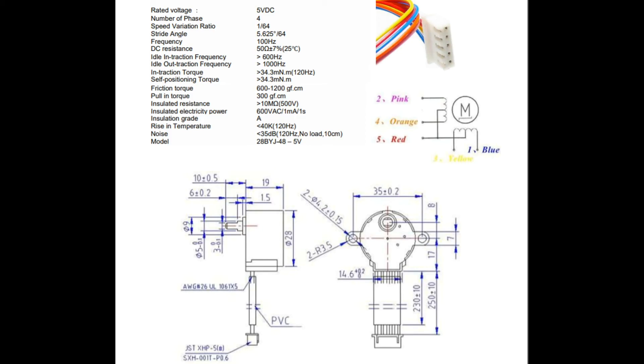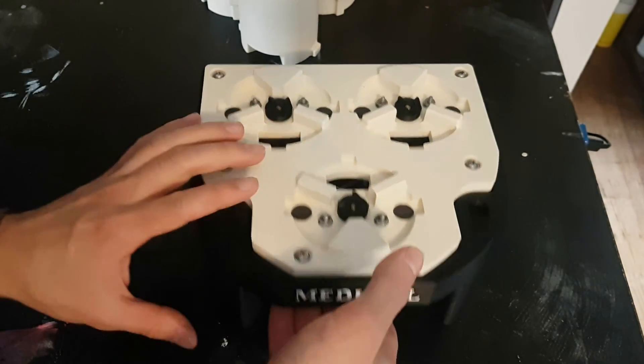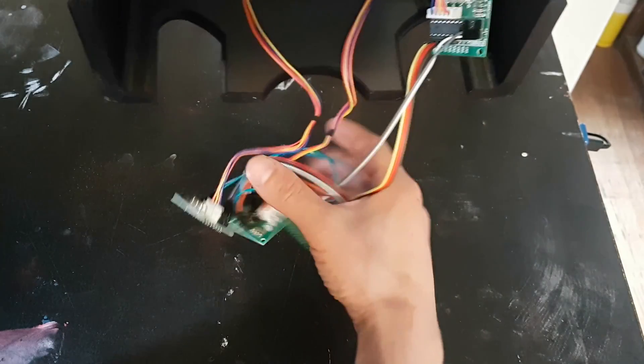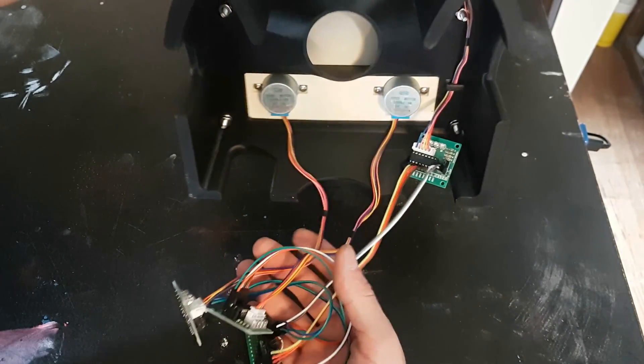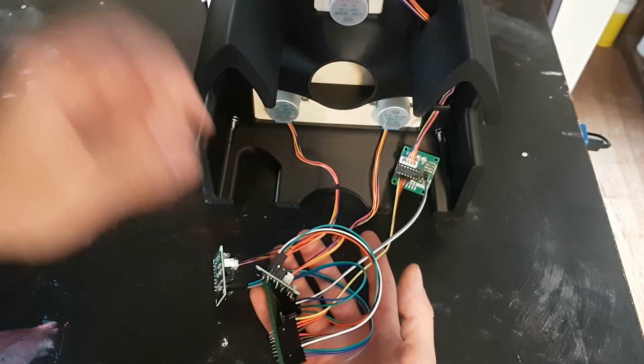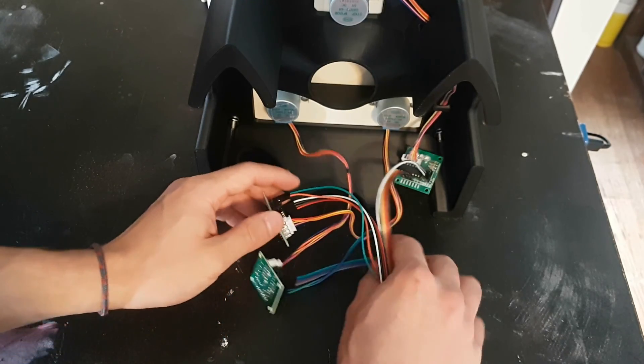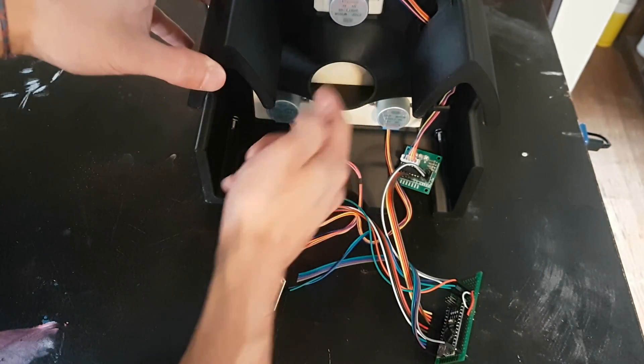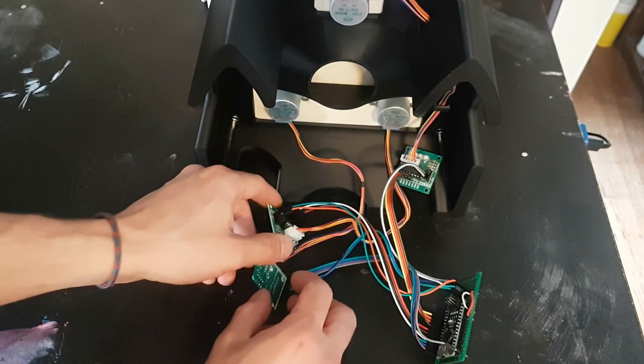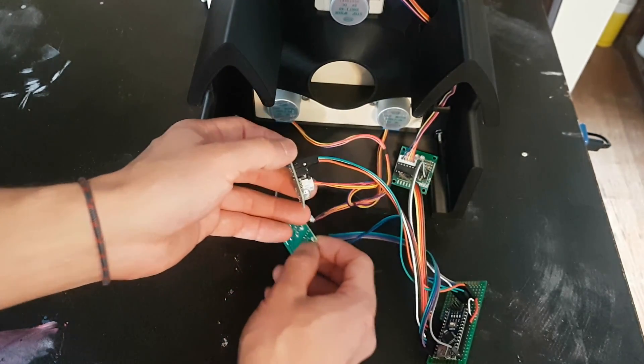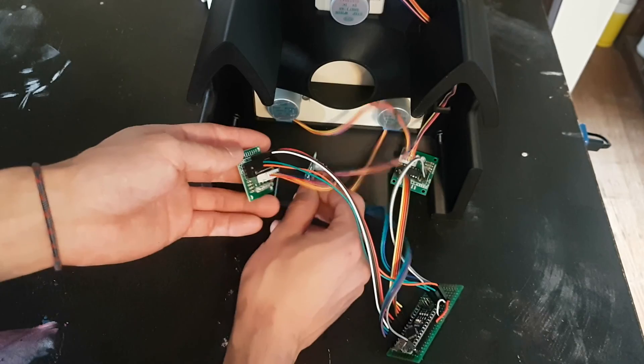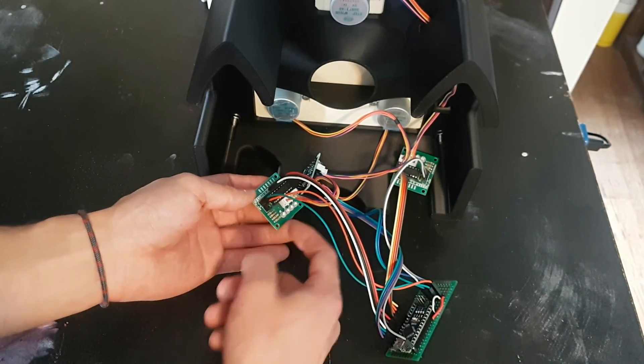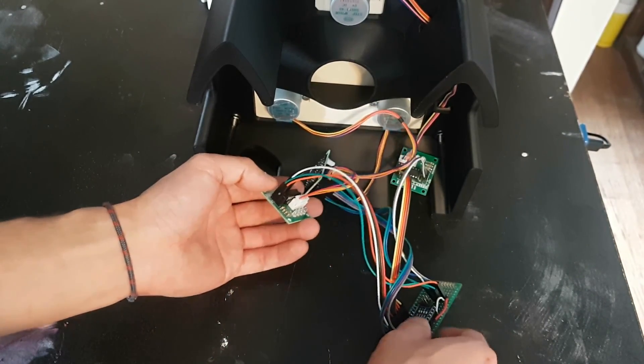This is the data sheet of the 28BYJ stepper motors. Now if we flip the Medipel over, we can get a better look at the electronics. These are obviously all fastened up and contained now. We kept it loose for this part of the presentation just to be able to better show the electronics. These here are the stepper motors. Those are ran through a ULN2003 driving integrated circuit, which is just a simple H-bridge design that helps regulate the power.